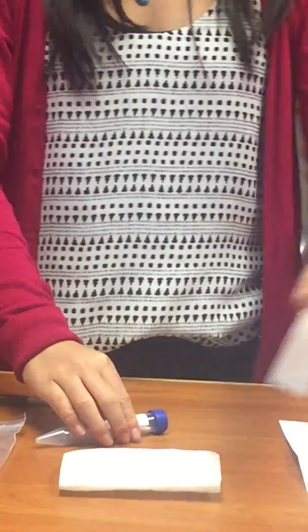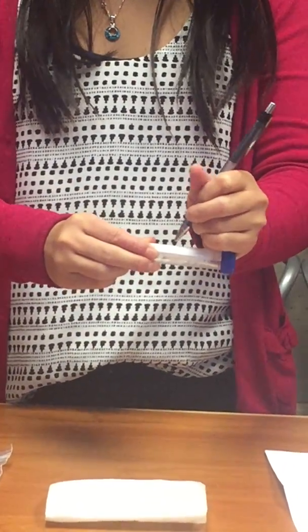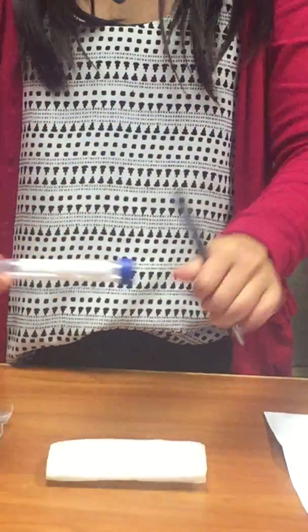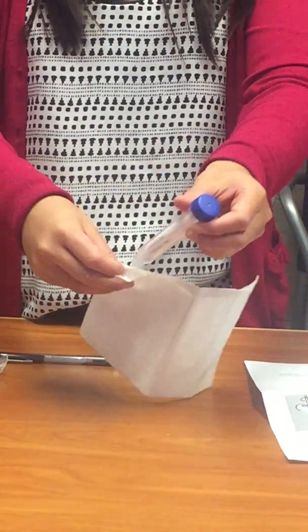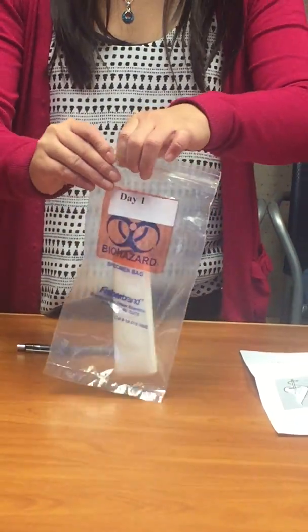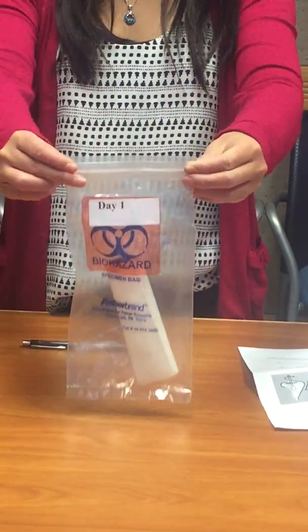Write date and time of collection on the labeled vial. Once finished, place vial in white absorbent sleeve and place this into a small biohazard bag. Immediately place in the refrigerator until it is time to ship the samples.